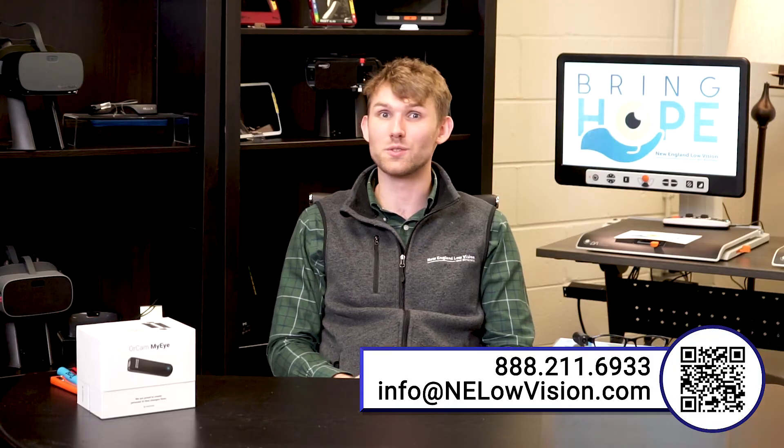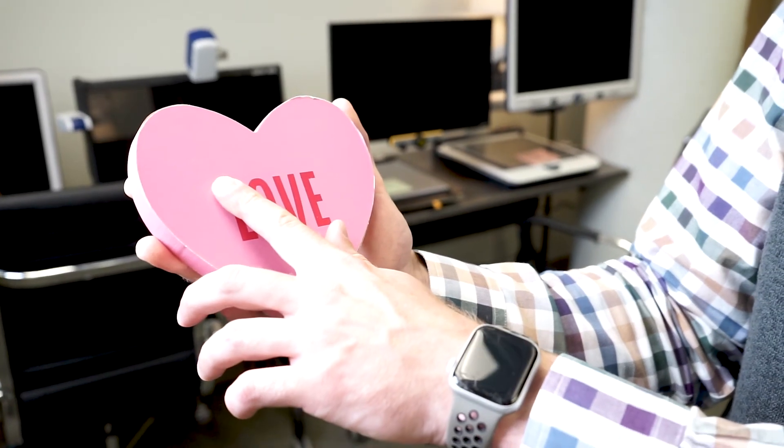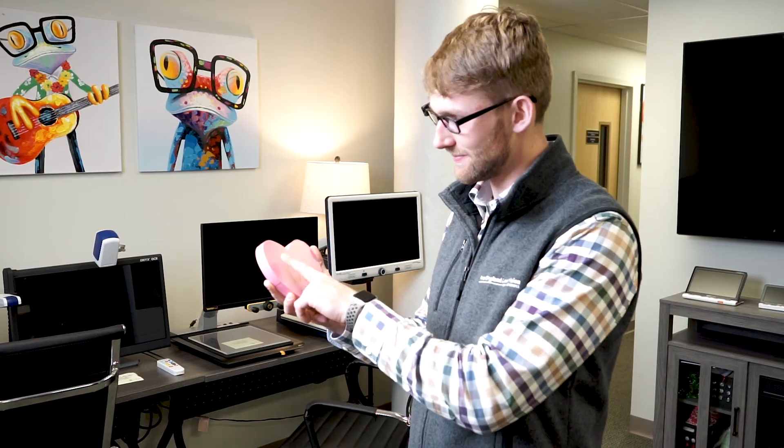If you're experiencing color blindness or trouble color-coordinating clothes, the MyEye does color recognition. It's very easy to activate — if I wanted to know the color of this heart right here, I would just point to it. The device says "Light pink area" and tells me the color of the heart.